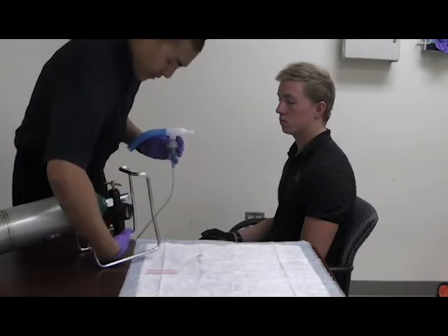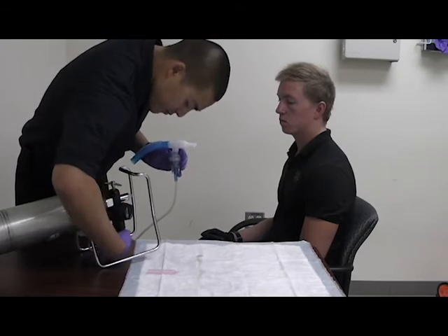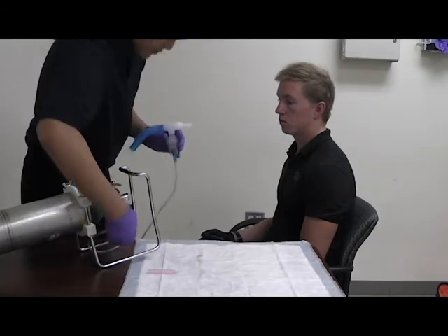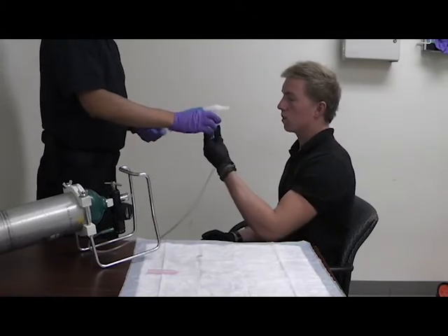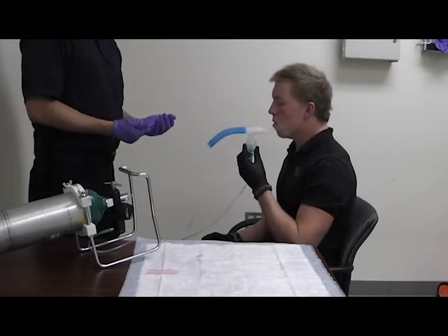The flow rate should be roughly about six to eight liters. Once I've determined the flow is good, I'm going to hand it to my patient, instruct them to inhale it, and hold the medication in as long as possible.